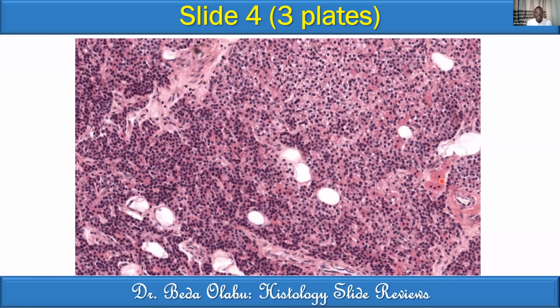The third largest, with clear cytoplasm, are clear cells. And the smallest cells, with very thin, deeply staining cytoplasm, are the principal cells. So, four cell types of the parathyroid glands. You know their functions from the recordings.